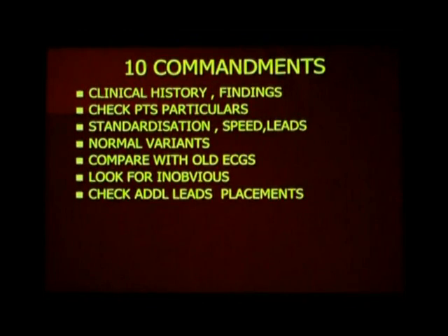Certain times, especially in children, or if the patient has a right ventricular myocardial infarction, or you are suspecting dextrocardia, you must take additional leads on the right side. Or if you want to get the posterior leads, in certain situations there may be additional leads. Although conventionally we say we have 12 leads, you may need additional lead placements in congenital heart disease, right ventricular myocardial infarction, and also in dextrocardia.